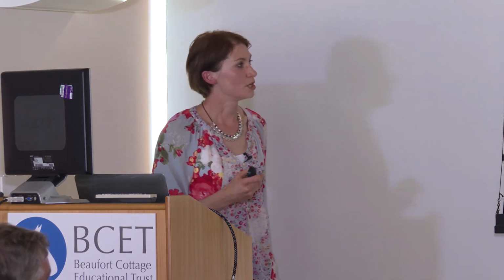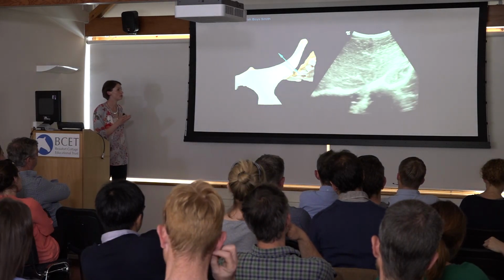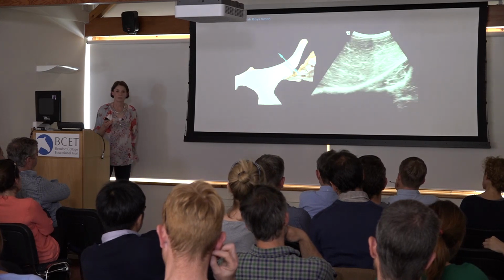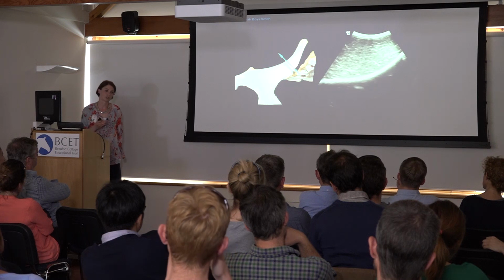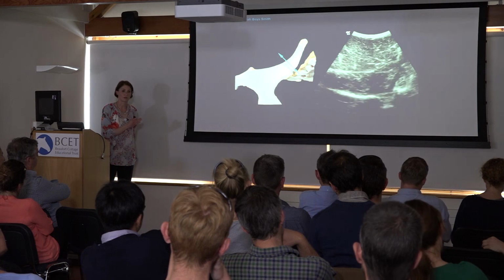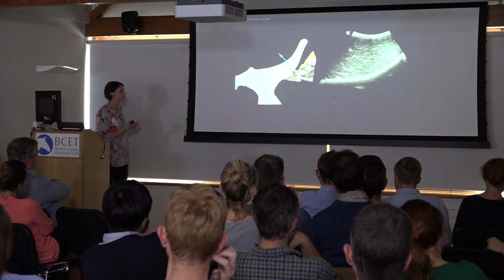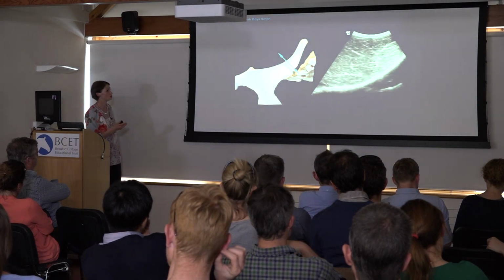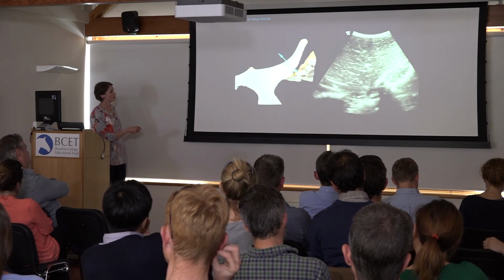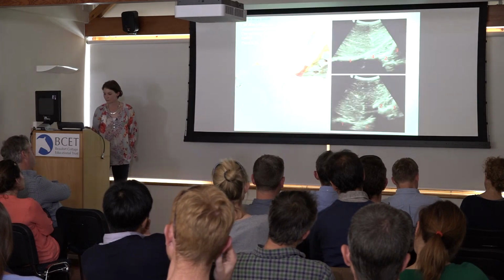It's really important to make sure you scan the entire width of that ilial wing, right from the cranial to the caudal aspect. A lot of ilial stress fractures, or the vast majority of ilial stress fractures in thoroughbreds, will start from the caudal margin of that ilial wing and won't necessarily go all the way cranially. So if you just scan the cranial aspect of the ilial wing, potentially you could miss something. Right at this caudal aspect here, we'll visualize the caudal aspect of the sacroiliac joint.